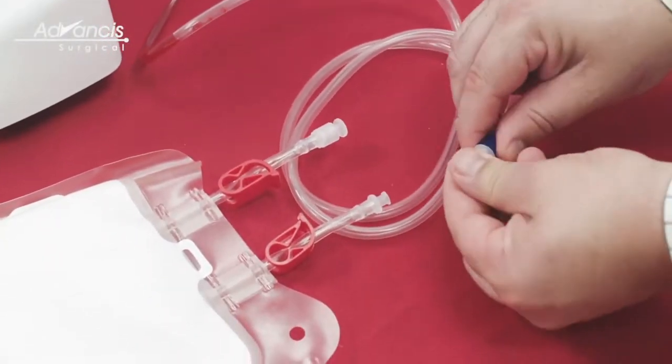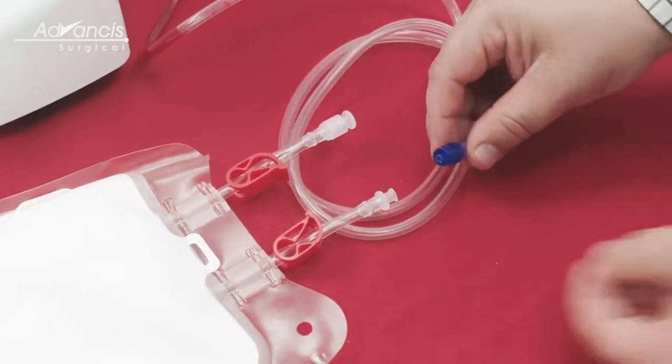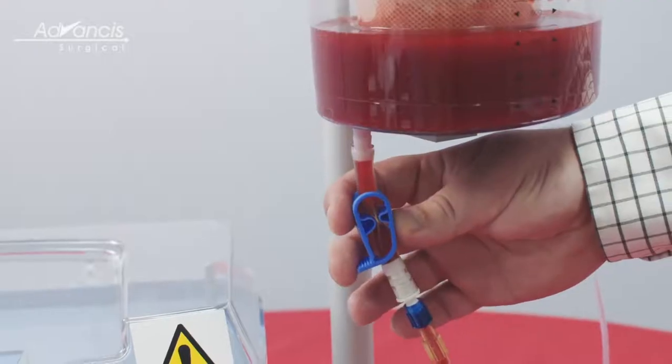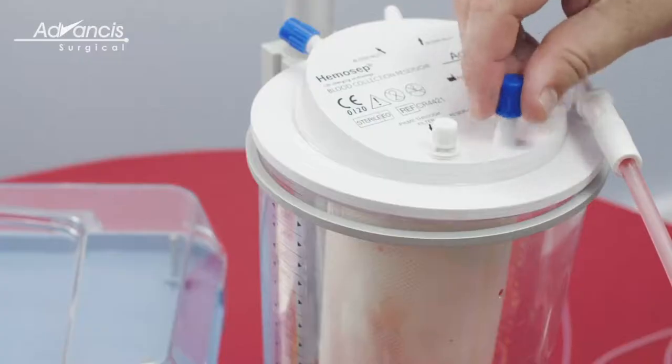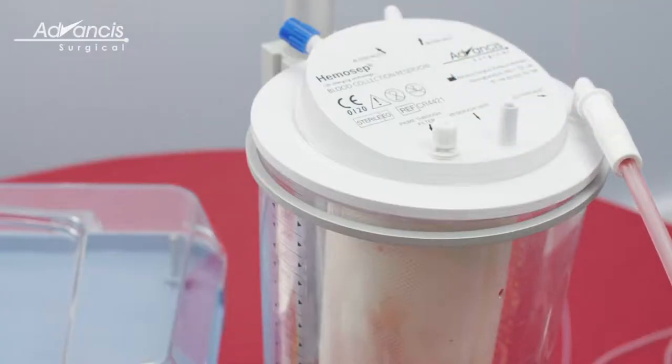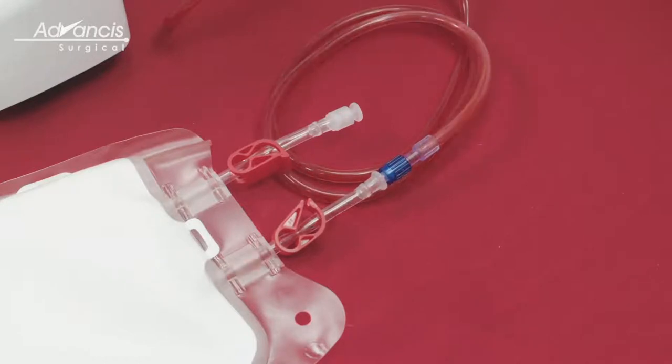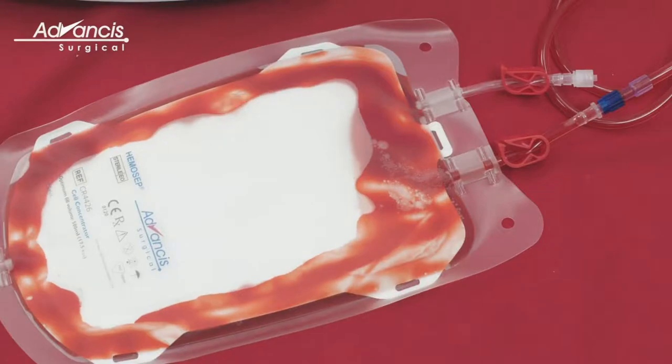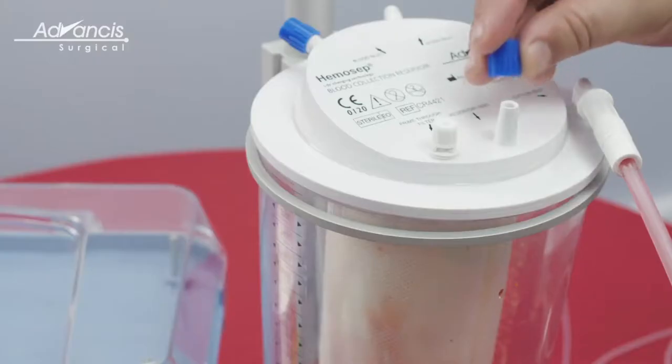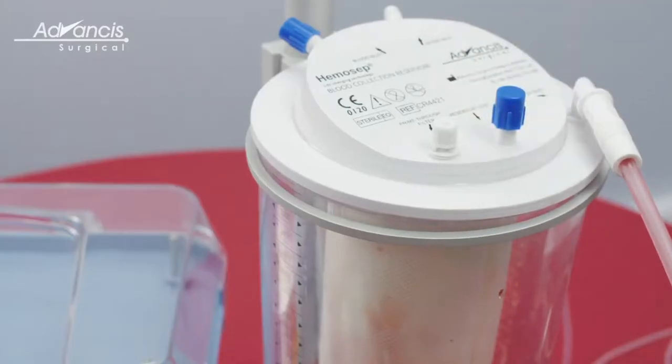Connect the primed blood bag to the blood collection reservoir and open the clamps. Lift the cap on the reservoir vent and blood will flow from the reservoir to the bag. Once the bag is full, replace this cap and continue collection from the surgical field.